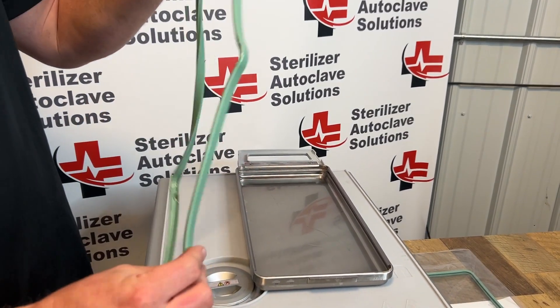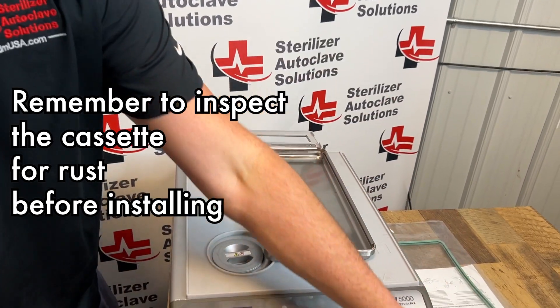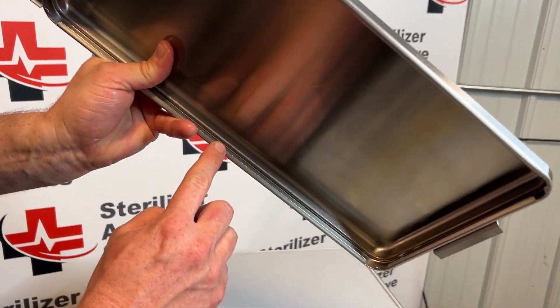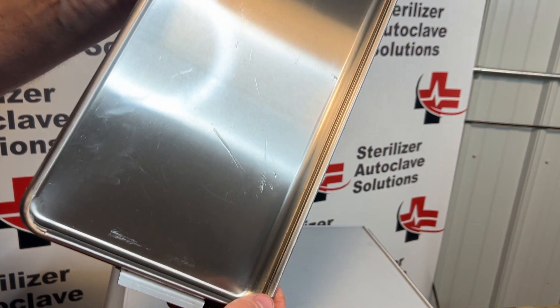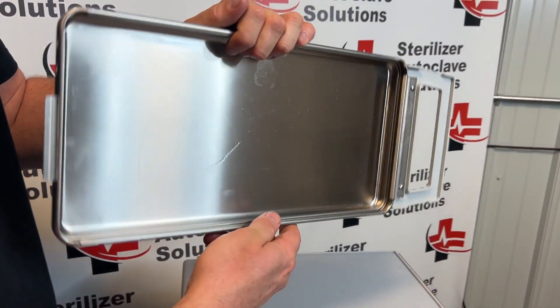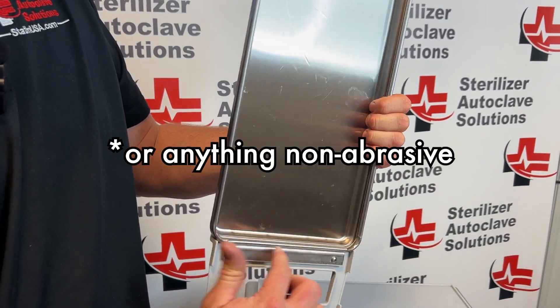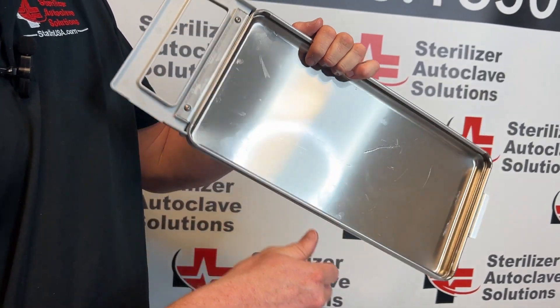This is a new seal so I will be reinstalling this one, however we do want to inspect our cassette. Make sure there is no rust or debris anywhere inside. If there is, you can use Scotch-Brite, Barkeeper's Friend, or anything non-abrasive to help clean up that rust. Just make sure you rinse it out.